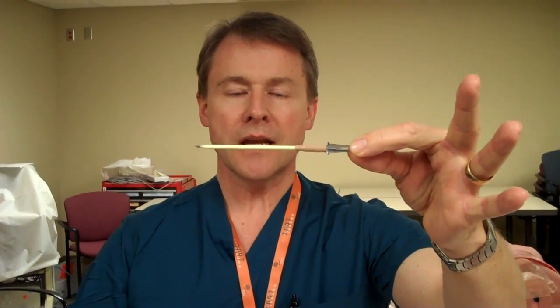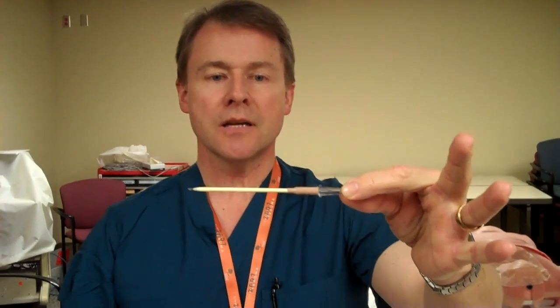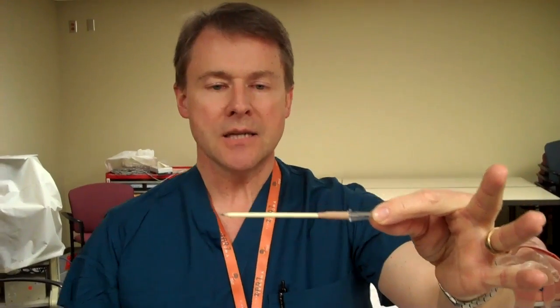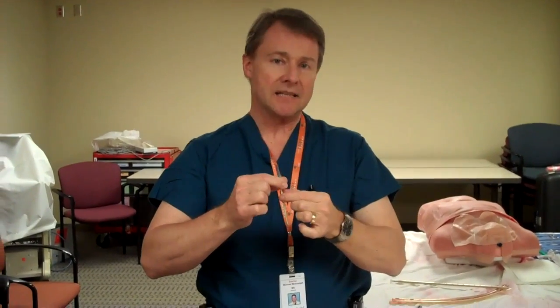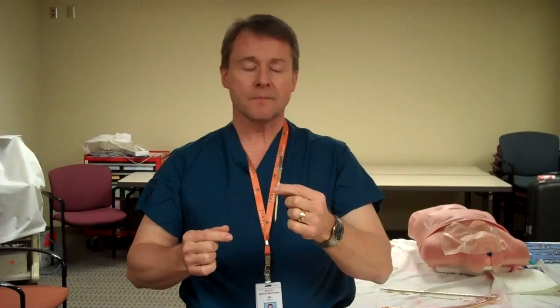What I recommend is actually something this size — it looks like a nail. It's a 10-gauge, four-inch catheter. The other advantage to this is that it is very, very stiff. Typically, the smaller 18-gauge catheters, or even 16-gauge, once they go into the chest, they tend to bend and lose their effectiveness almost as soon as they go in.